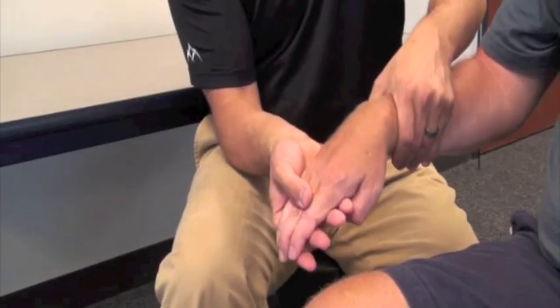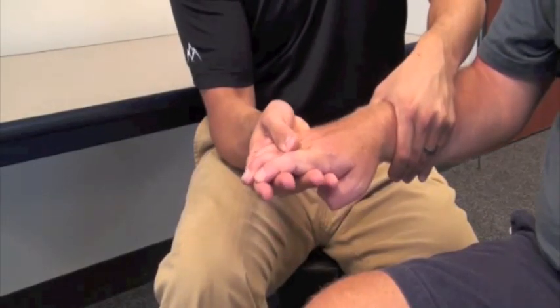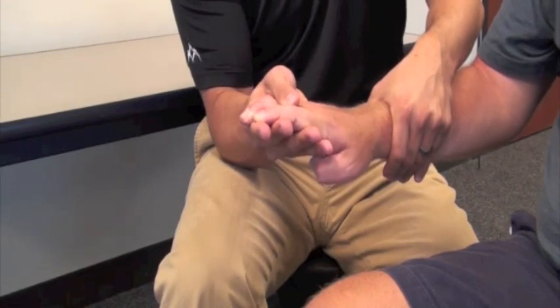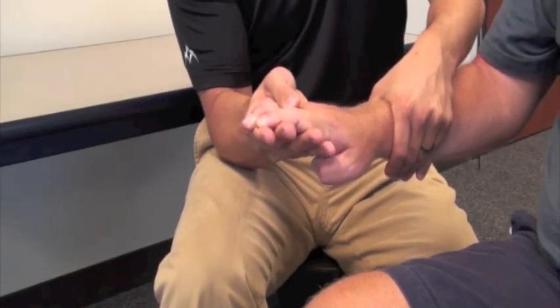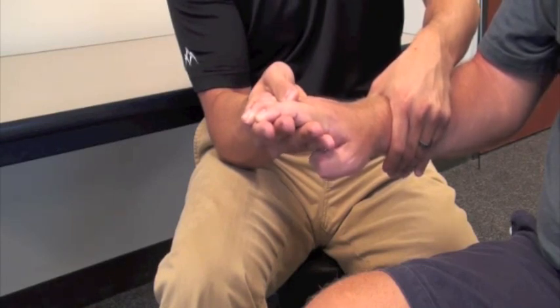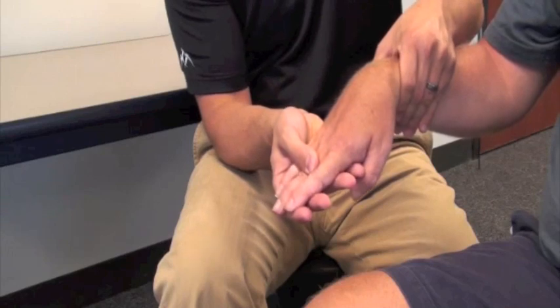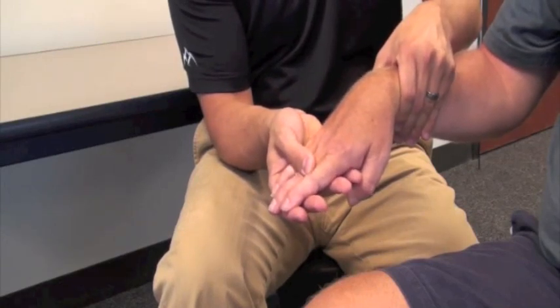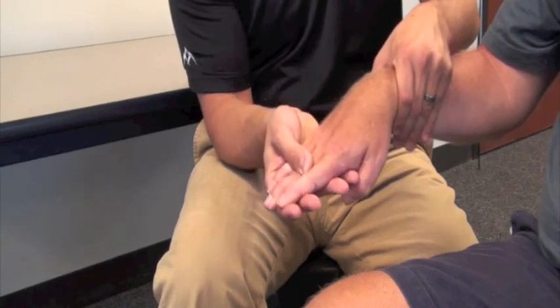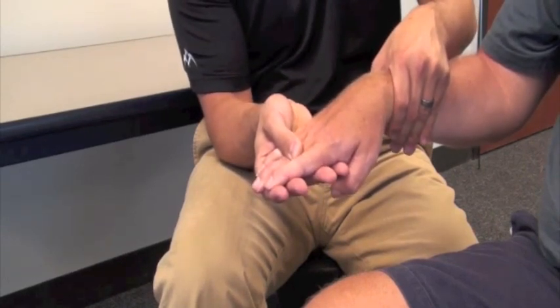For Tony's situation, the best position will be about plus five degrees, where we start to feel that resistance. For chronic patients, it's not uncommon to set the wrist angle initially at neutral or slight flexion. In some patients, you'll start to feel the resistance right around minus 10, minus 15, even minus 20 or 25 degrees — and that's not uncommon.